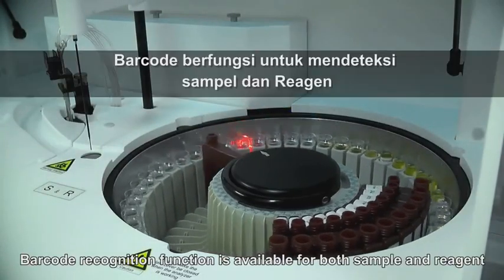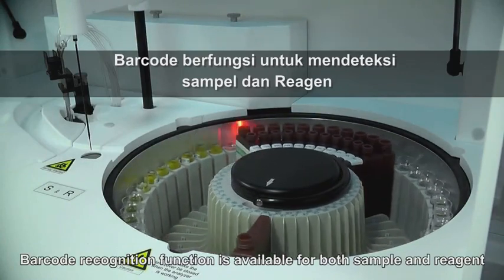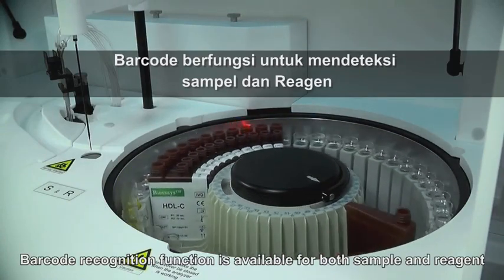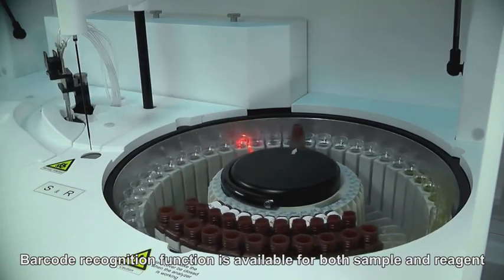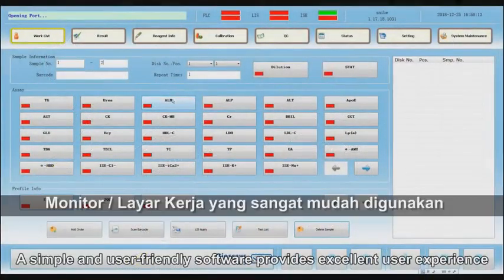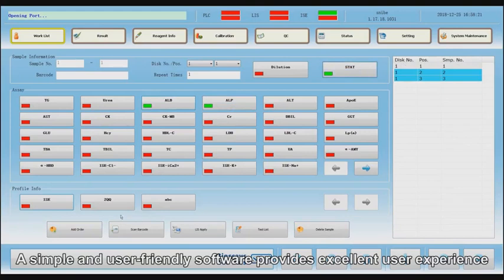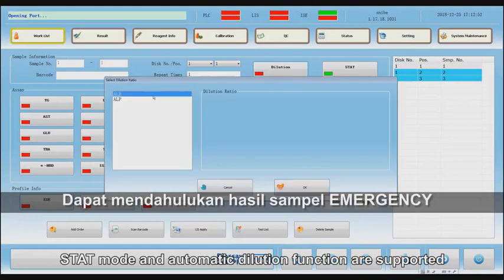Barcode recognition function is available for both sample and reagent. A simple and user-friendly software provides excellent user experience. STAT mode and automatic dilution function are supported.